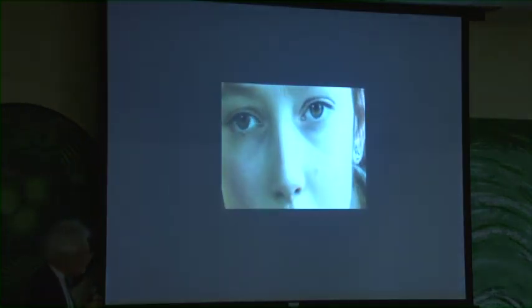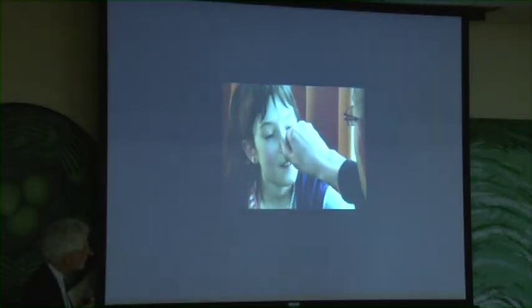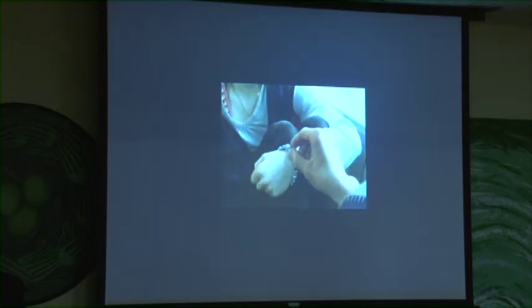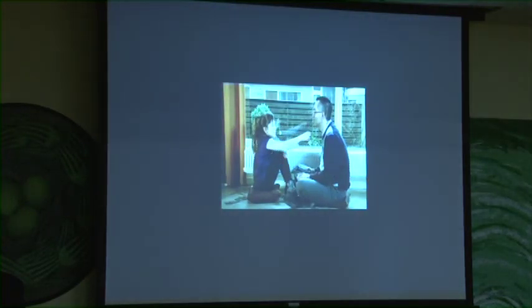Wird erkennen? He's been blind for about 10 years, no light perception, and this is his daughter, and he's recognizing her facial features. Greift zielstrebig an die Nase. Und ans Kinn. Und dann hat was entdeckt, was glitzert. Kette. Und dann zieht Margot auch noch an den Ohren.